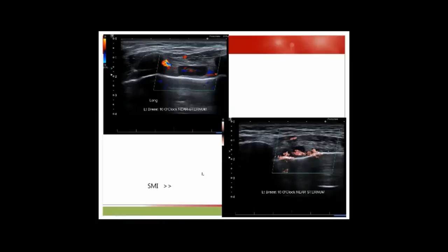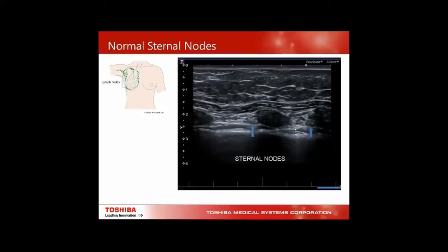SMI (Superb Micro-vascular Imaging) is a very nice way of detecting low colour flows — another Toshiba tool. Normal sternal nodes can be seen between the sternum with the costal cartilage; you can identify the echogenic hilum.